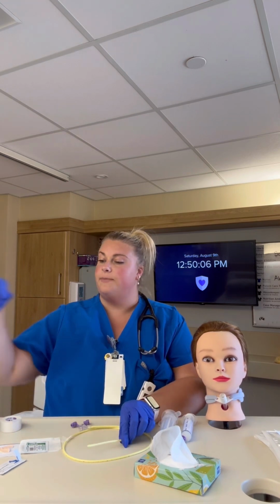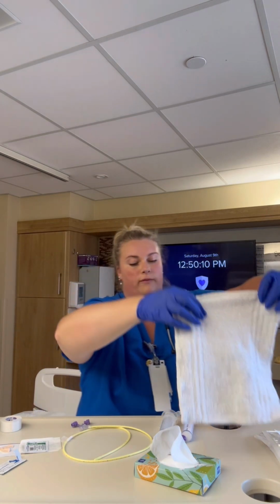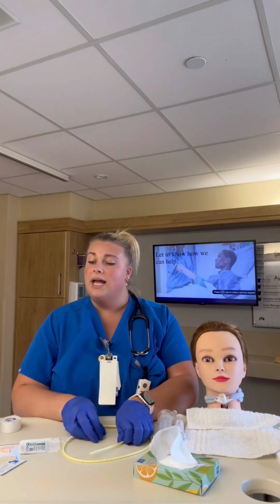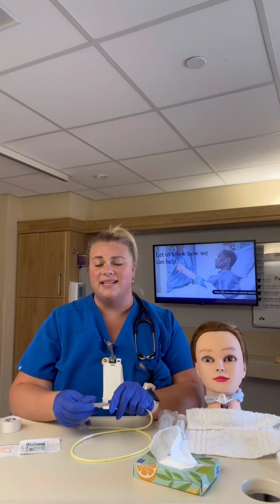Next, we're going to prepare the patient by putting a towel over their chest. This makes sure to keep the patient clean should anything fall or drop during the procedure. Next, we are going to lubricate the tip of our NG tube. Once again, this just enhances comfort for the patient during insertion.